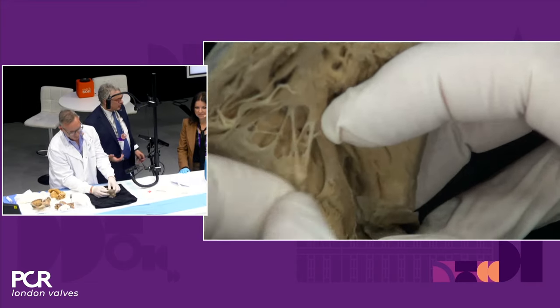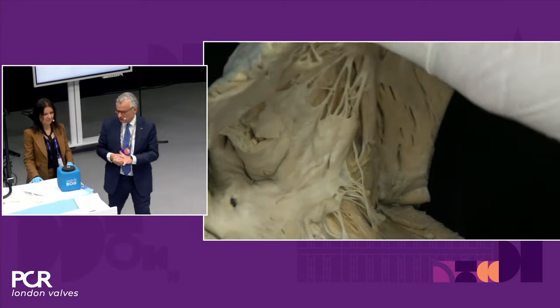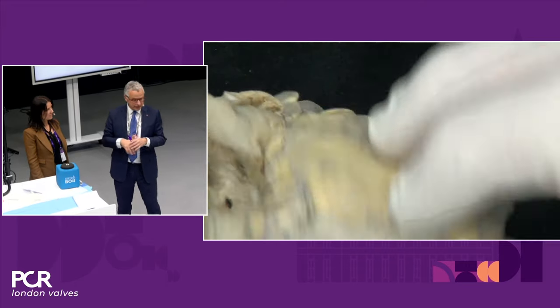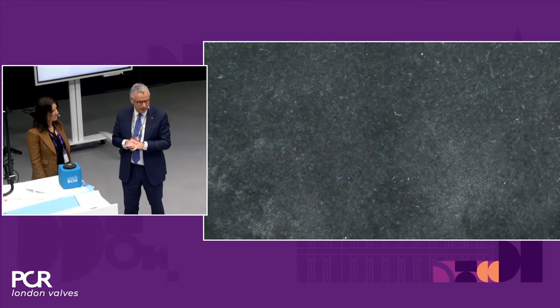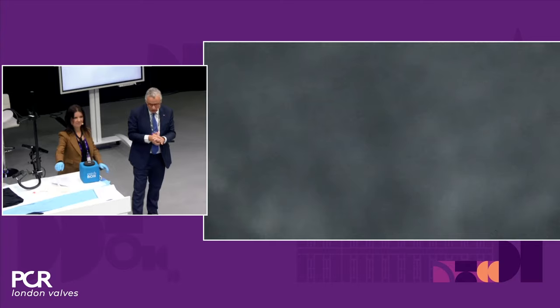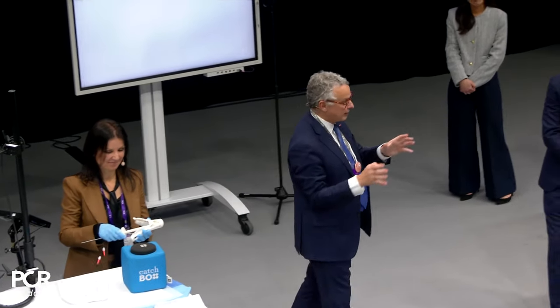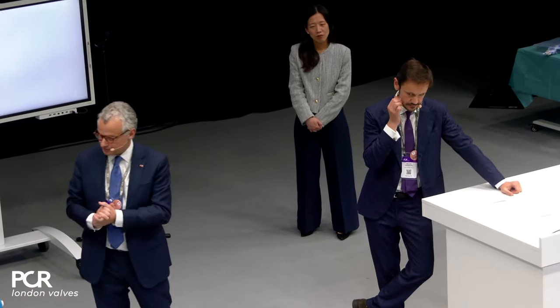Obviously, this is a specimen with formalin, but it's something that we probably don't realize when we do these procedures: the grippers themselves are really very soft and atraumatic. So multiple repositioning is possible. Obviously, you need to be very careful when you move around the cords. You can still get entangled and get in trouble. But it's not about managing the closure system.